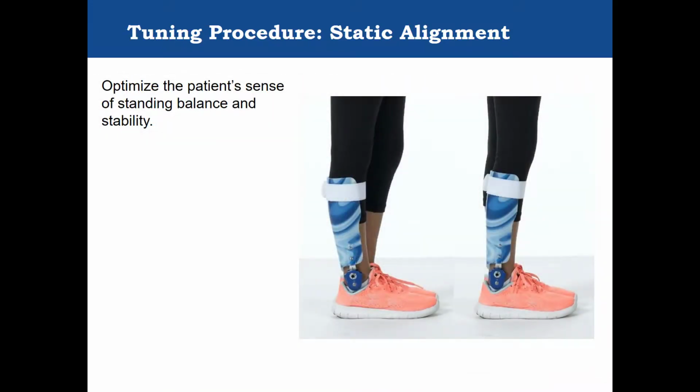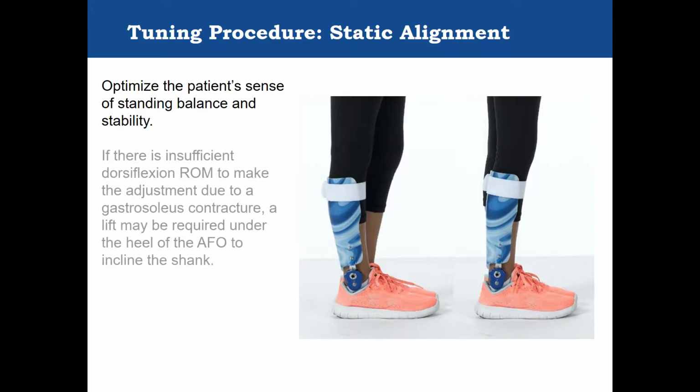During this procedure, optimize the patient's sense of balance and stability using subjective feedback and objective observation. If there is insufficient dorsiflexion range of motion to achieve stability, it may be necessary to lift the heel of the AFO in the shoe to incline the shank.